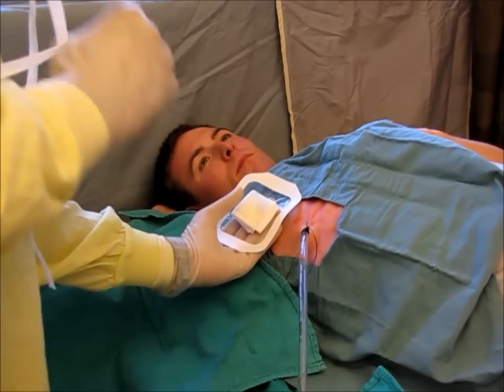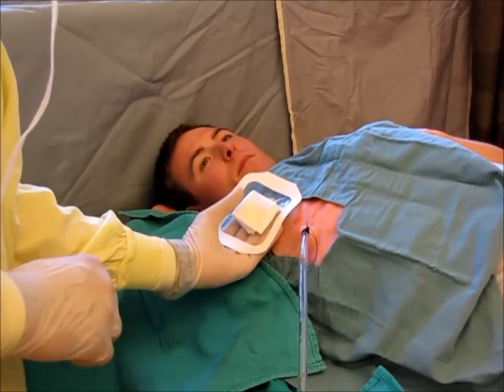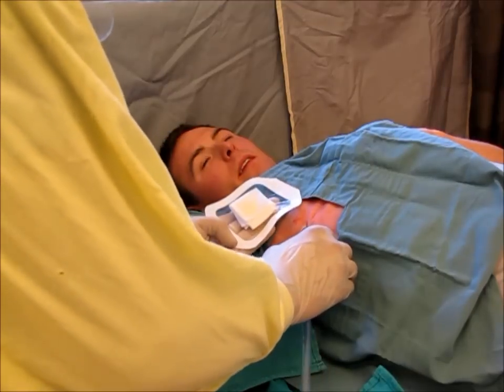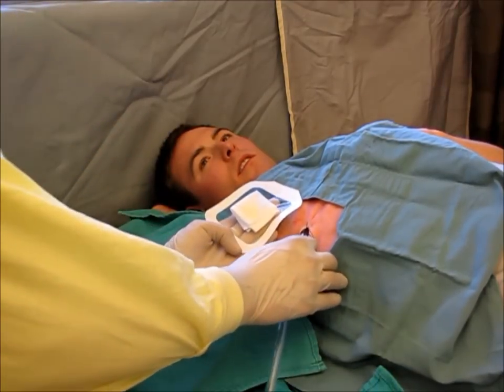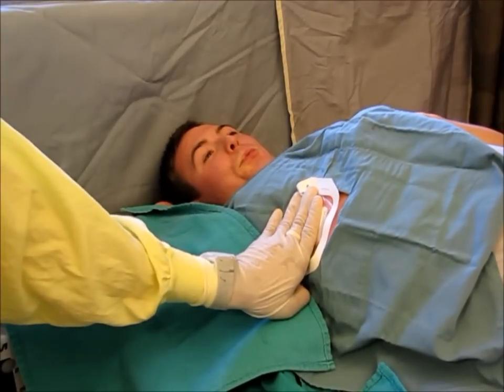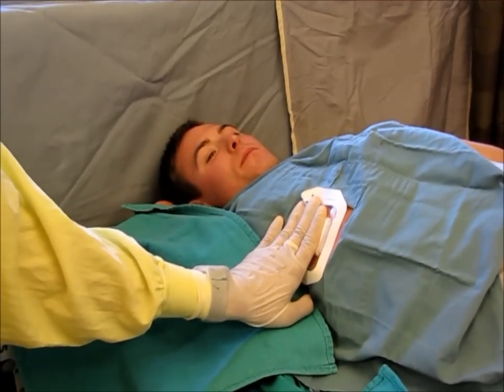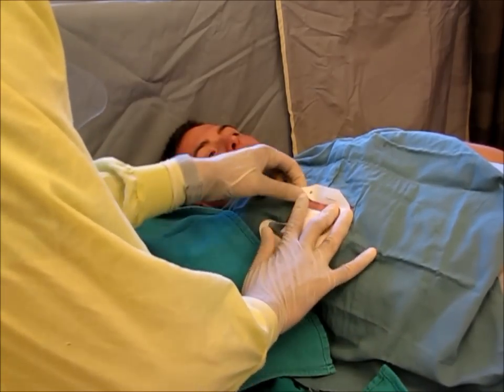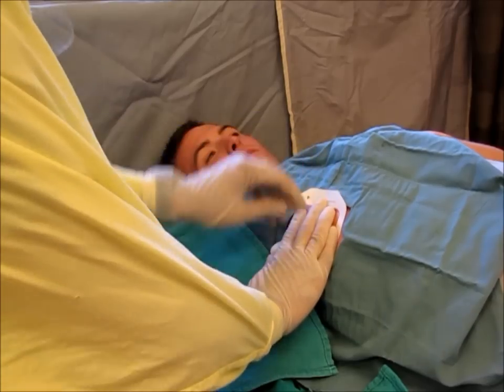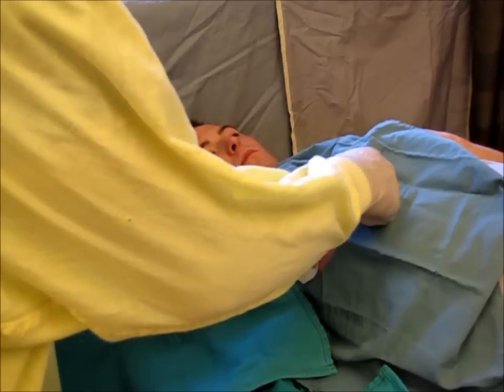Count to 1, 2, 3 — have the patient take a large breath in and blow out through pursed lips. Remove the tube at the maximum of inspiration, just as the patient starts to exhale. Keeping pressure with your non-dominant hand, ensure that the Tegaderm is pressed down on all four sides around the occlusive dressing. If need be, you can reinforce with further dressings.